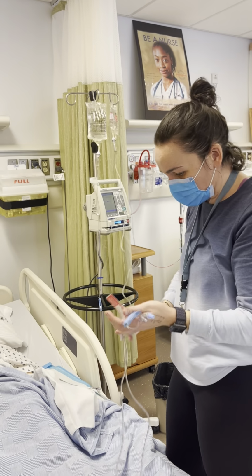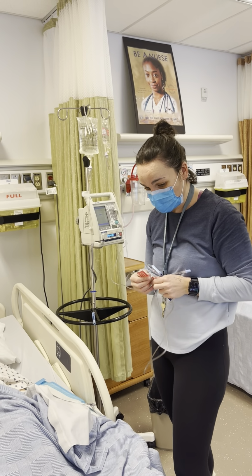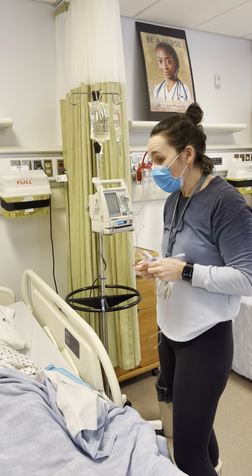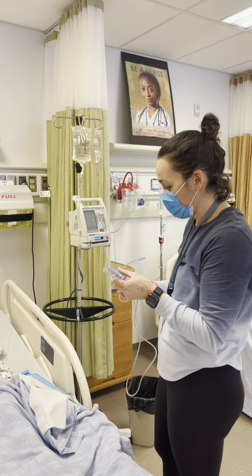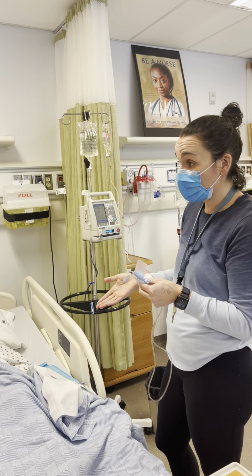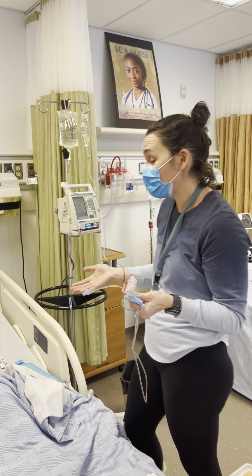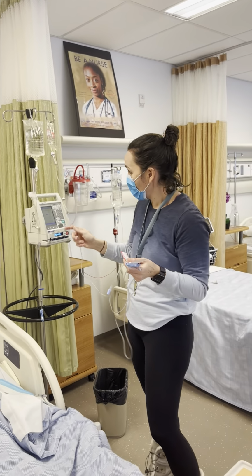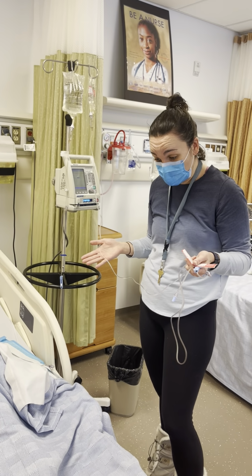And now we'll just explain to him what the insulin is for. So we'll tell him the doctor ordered you insulin because your blood sugars are a little high. This is just to keep them under control. And then you can give him some side effects of it. So hypoglycemia, so if he's feeling hungry or thirsty, or if he feels like he's going to lose consciousness, then to ring his bell right away and let us know if he has any sort of symptoms. We will give him the right to refuse here at this point too.